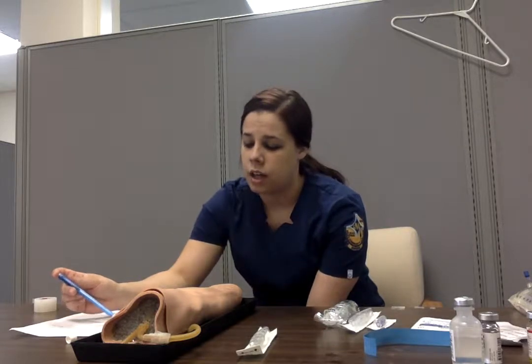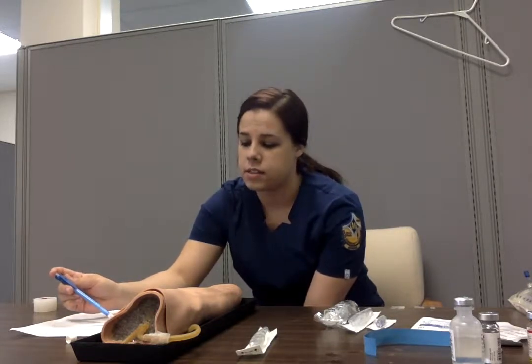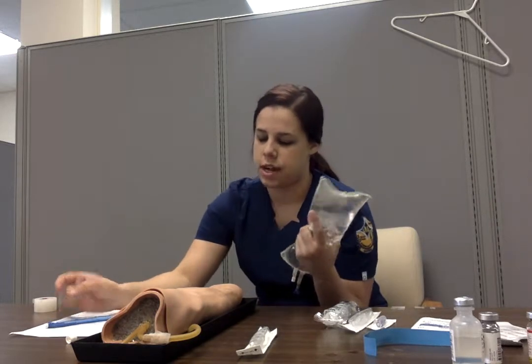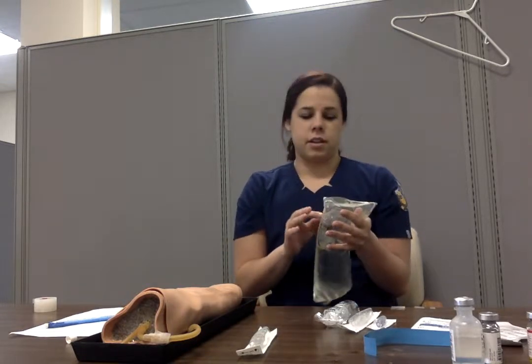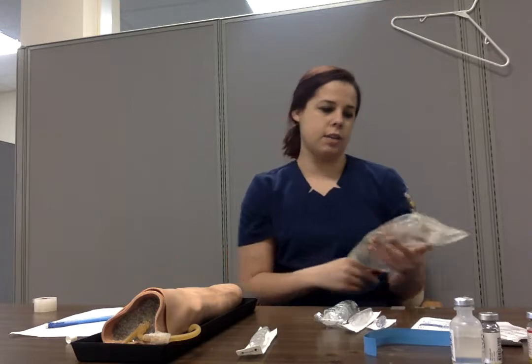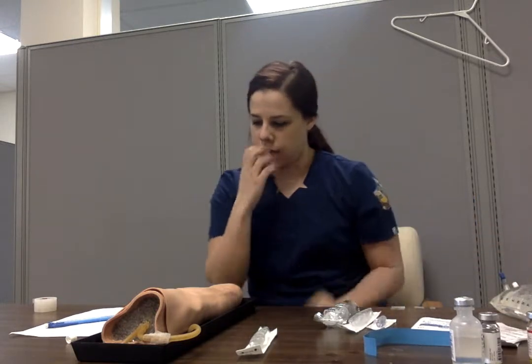he needs IV NS 0.9, 1,000 ml bag, and to infuse over 6 hours. So I would label this with the patient's name, date, my own initials, the infusion rate, and the time that it would start, which is at 8, and end, which is at 1400.